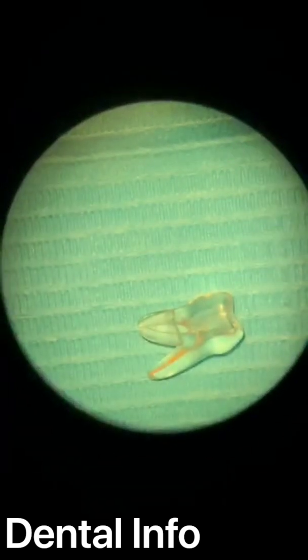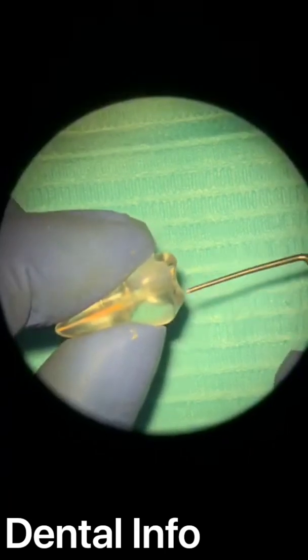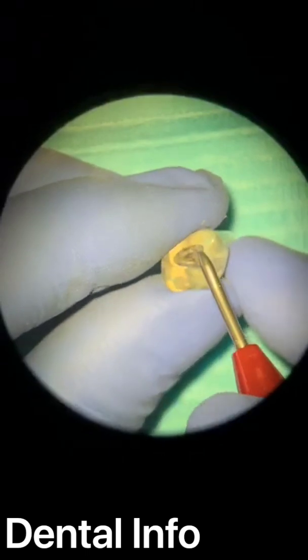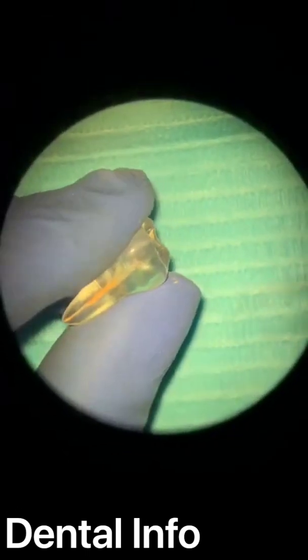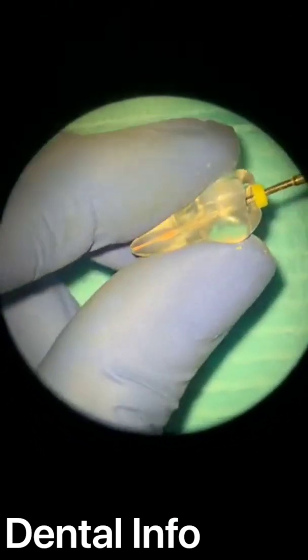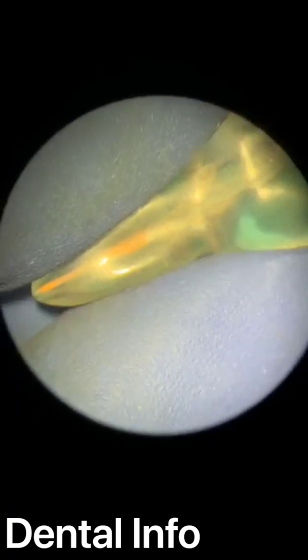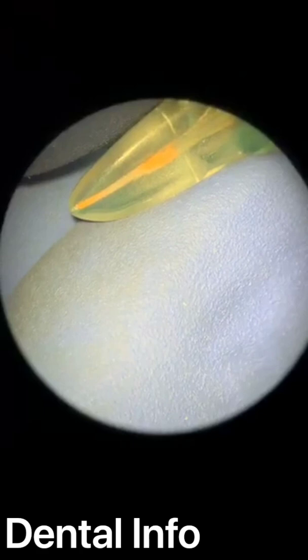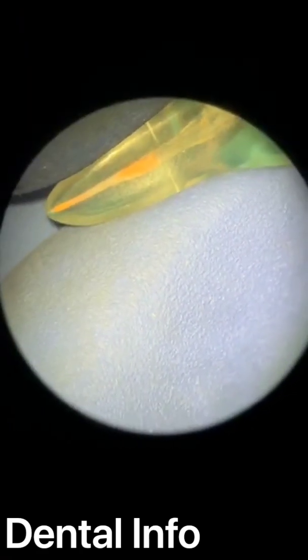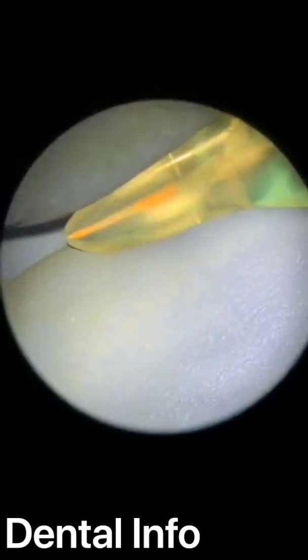Okay, I remove and I bring my spreader, and I will condensate my gutta percha, or you can use this tip with button off. Do not switch it on, and I will magnify here and will show you what I'm doing. My gutta percha is not up to here. No, it's up to here. But this is on the walls, so I have to compact it or even cut it if it's too much.